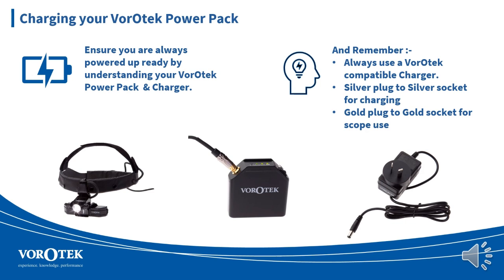The VorOtek Power Pack can offer approximately 10 hours of run time per fully charged load. To check the battery level or charge load of your VorOtek Power Pack, simply switch on and view the 4 illuminated lights at the top of your power pack. All green lights means your power pack is fully charged. These will start to reduce as you use your power pack, giving you an indication of the charge left available.